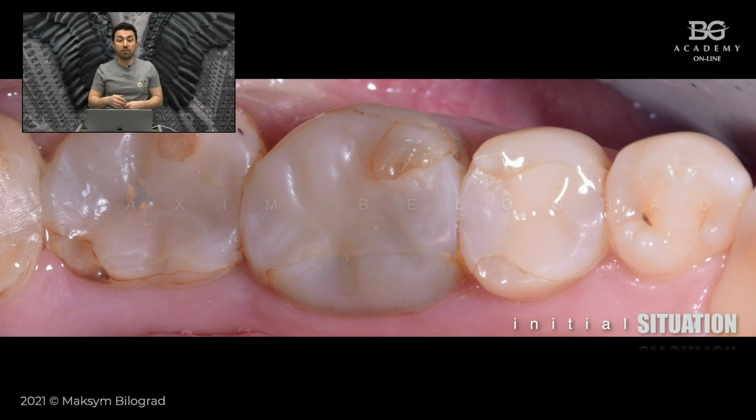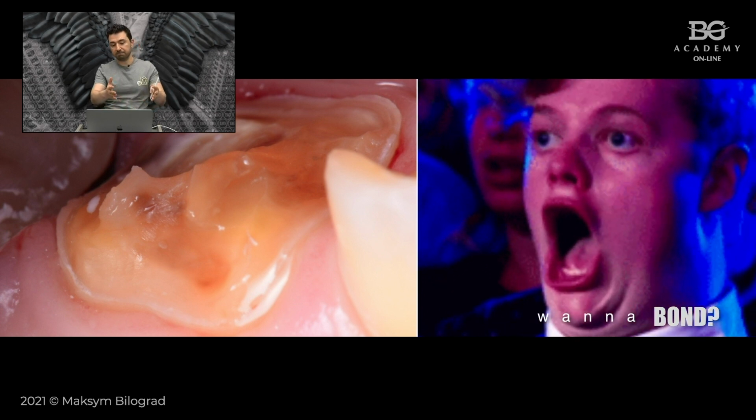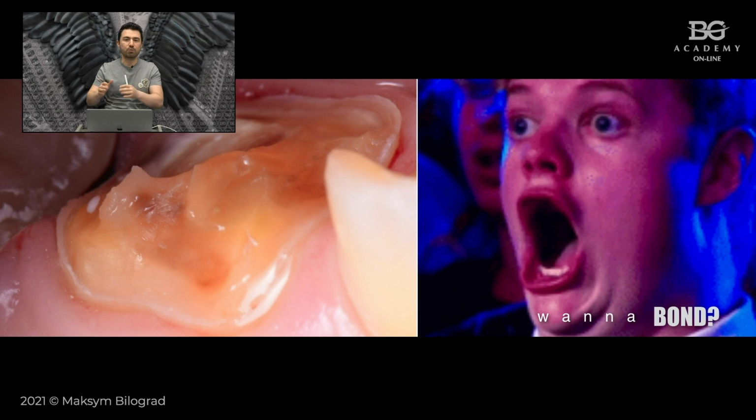We were replacing these fillings, and after I removed everything, including caries, I ended up with such a situation, and this was my face exactly.